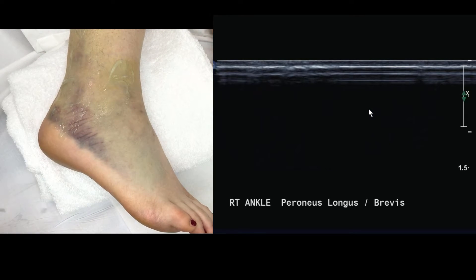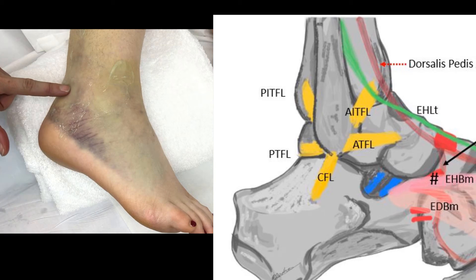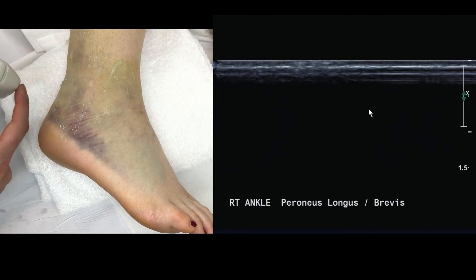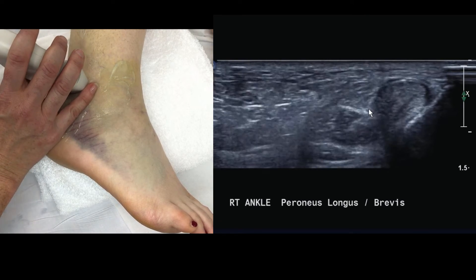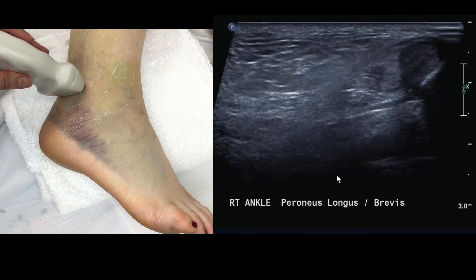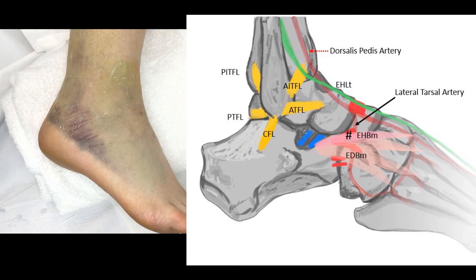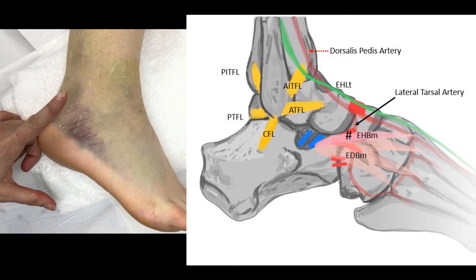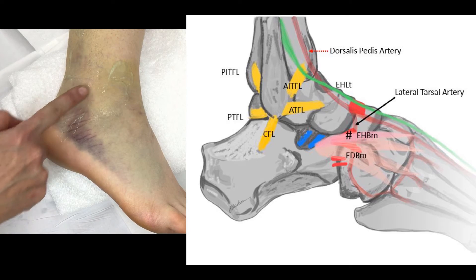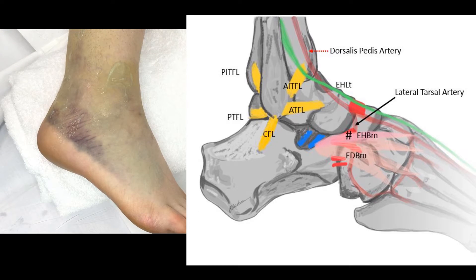The third and final lateral ligament is the posterior talofibular ligament — PTFL. For the ATFL we angle across to the big toe and plantar flex; for the PTFL it's true transverse with one end of the probe on the lateral malleolus. Because the PTFL is so deep, a lower frequency probe — such as a 12-5 — may be needed. For ligaments anterior to the lateral malleolus we plantar flex to tighten them; for those in line with or posterior to the lateral malleolus we dorsiflex. The same principle applies on the medial side.